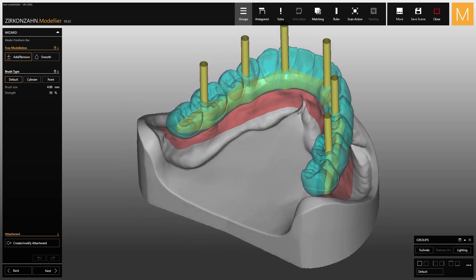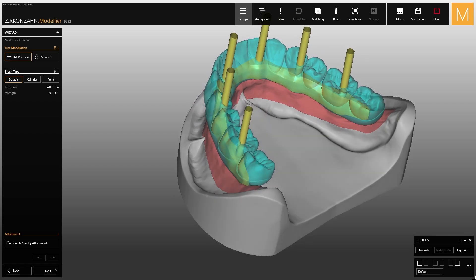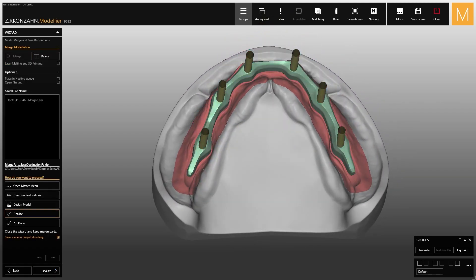Starting from an existing setup, proceed with the design of the metal bar until the end of the wizard. Make sure to incorporate the finished parts by selecting the laser melting option in order to have a uniform geometry for the surface.